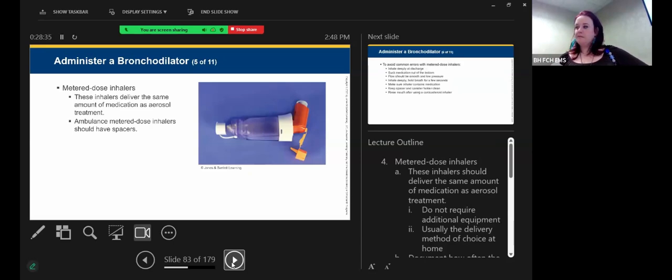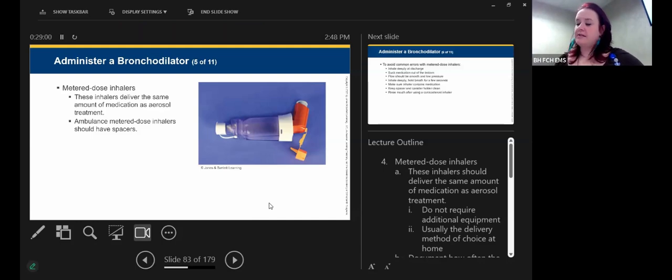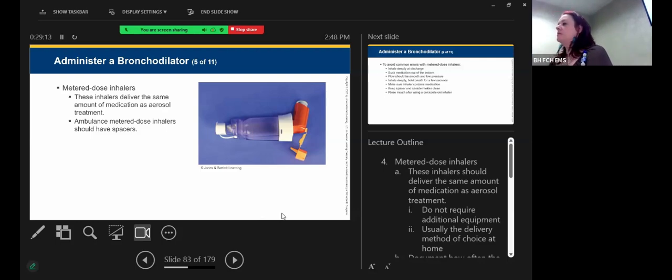Oh, I need to bring that up. Our masks we use for albuterol don't have the thing to hold them on the nose anymore. So what I'm finding is a lot of times I have to hold their mask on while they're doing their breathing treatments. So Terry's stating that on our nebulizer masks, the little metal piece is no longer at the top, so she has to hold the bridge of the nose to make sure the medicine is not leaking, holding the mask, and tape it. But that is something that's different. I don't know why we don't have those anymore. Cost effectiveness, I'm sure. That little strip of aluminum was probably 50 cents.